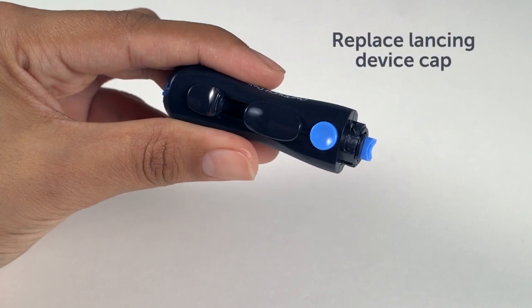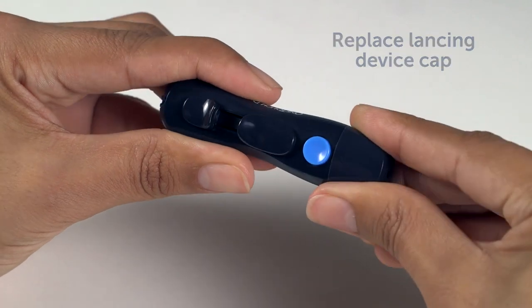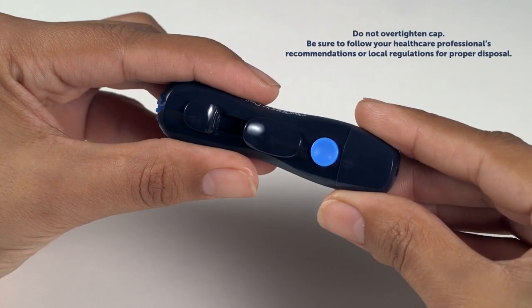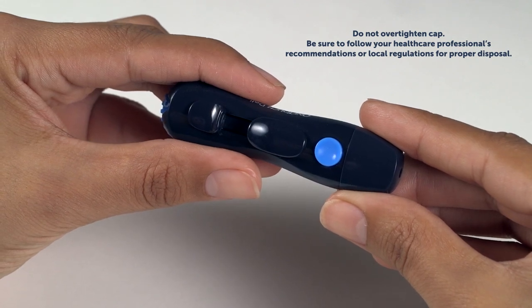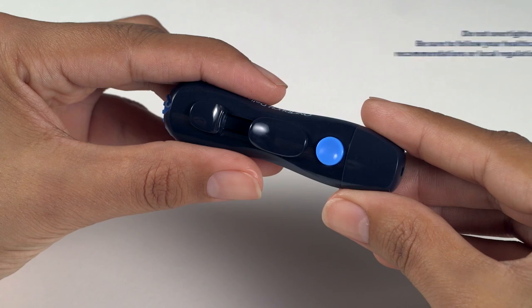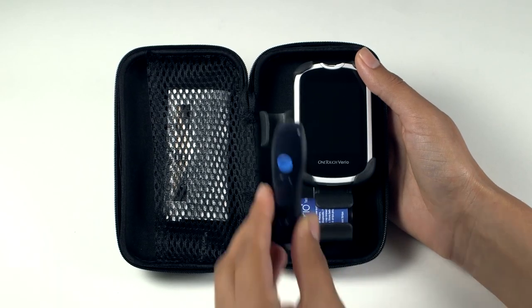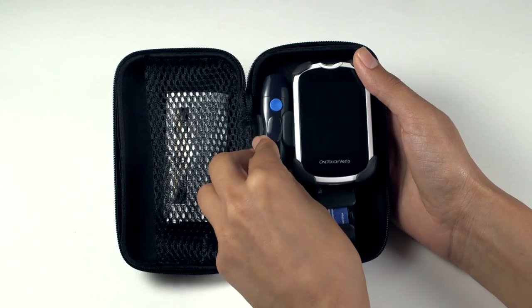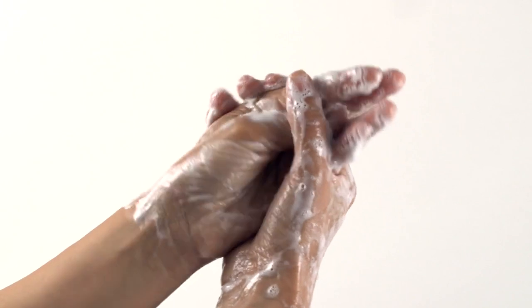Replace the cap on the OneTouch Delica lancing device, turning it clockwise to secure the cap. Discard the used lancet and test strip carefully after each use to avoid unintended lancet stick injuries. Used lancets and test strips may be considered biohazardous waste in your area. Be sure to follow your healthcare professional's recommendations or local regulations for proper disposal. Wash hands thoroughly with soap and water after handling the meter, test strips, lancing device, and cap.